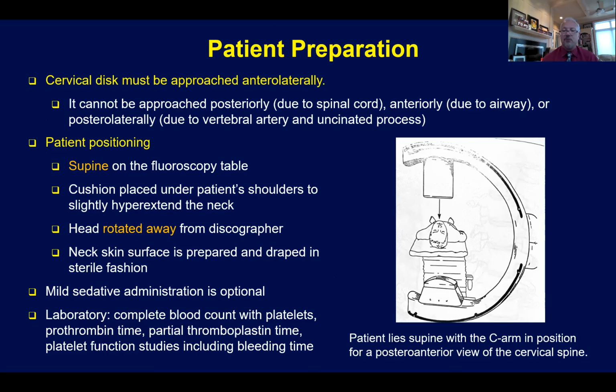I don't use sedation for discography. I want the patient to be completely alert and coherent and to provide verbal feedback about their symptoms and the pain level, but some authorities would authorize or at least advocate for the use of mild sedation. You've got to rule out bleeding diatheses, so it's obligatory to make sure the patient is, first of all, not taking an anticoagulant, secondly to look at the APTT and the PT and possibly the international normalized ratio when indicated.